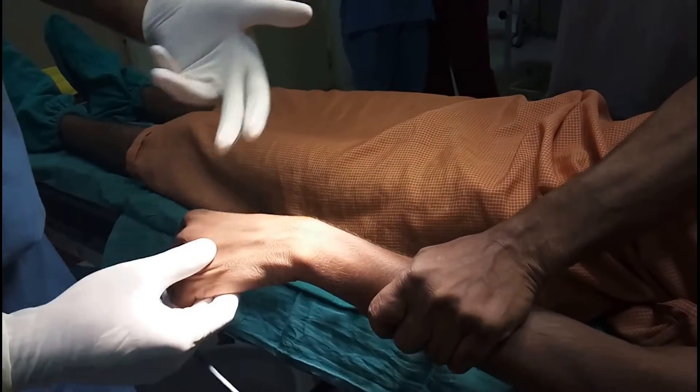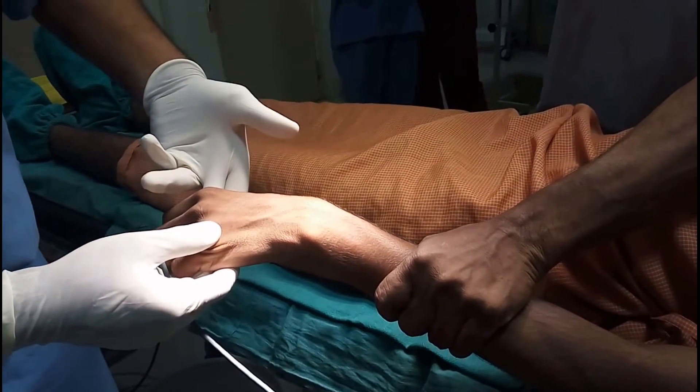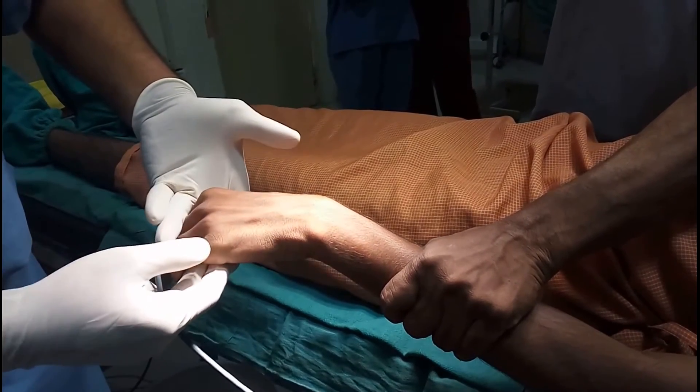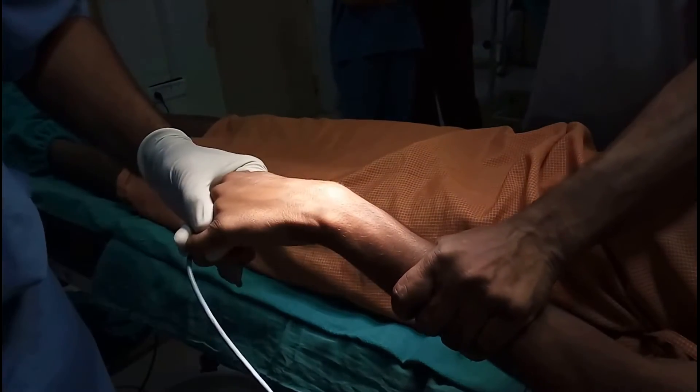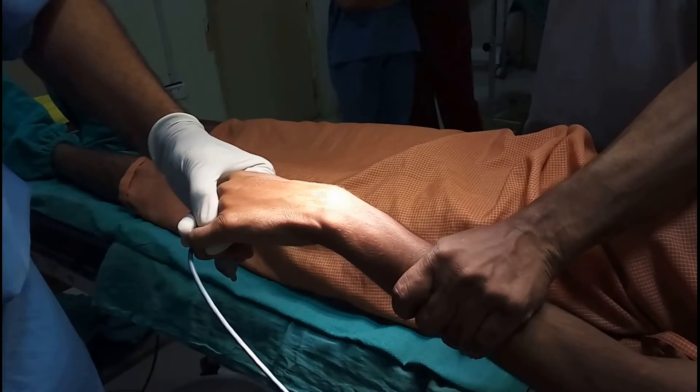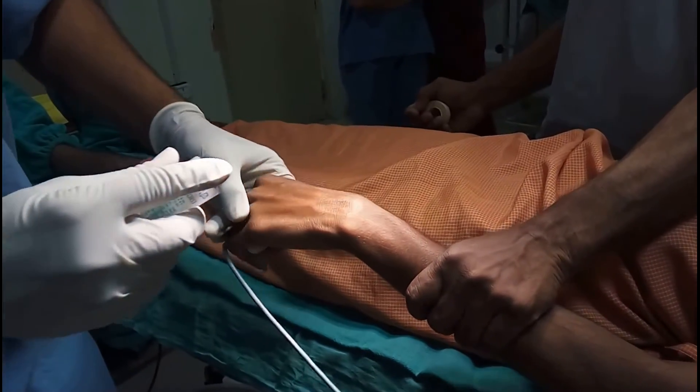The method is to put two fingers inside — if you are a right-hander, with your left hand into a fist — and two fingers outside, rotate outwards and tap on it gently. Then resanitize and go ahead with the cannulation process.